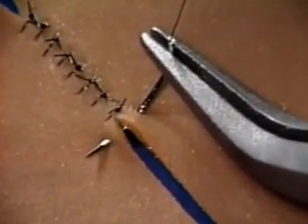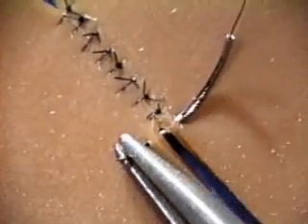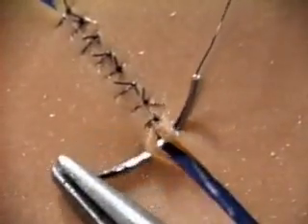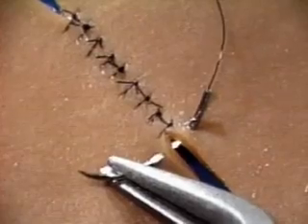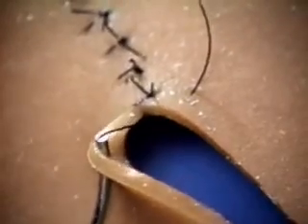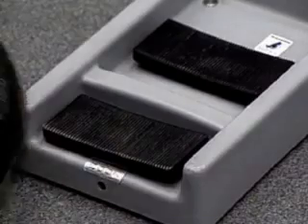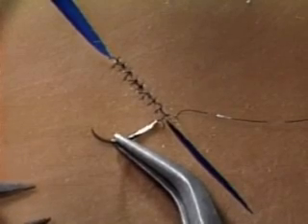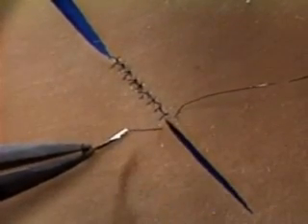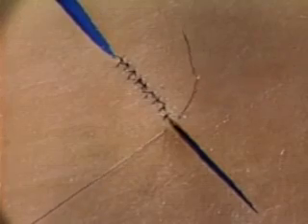Now that we've looked at those potential mistakes, let's get back to where we were. You've put the needle tip in and brought it out — now you have to pull the length of the needle through. Remember: pulling is more controlled than pushing. Pull the needle through with one or two straight pulls so that its tail end rides cleanly through the needle hole. Avoid pulling it sideways — that's very traumatic and on a blood vessel will give you a hugely enlarged needle hole. Once the needle is through, turn the magnification down before continuing.